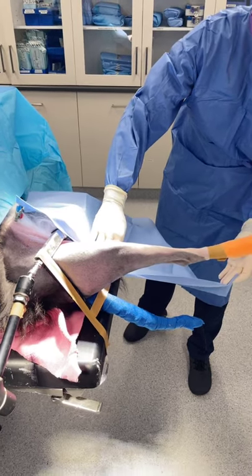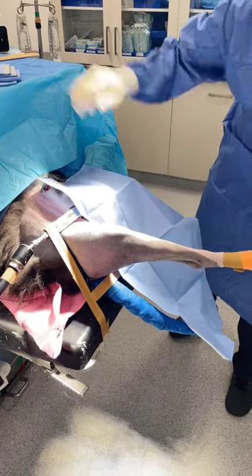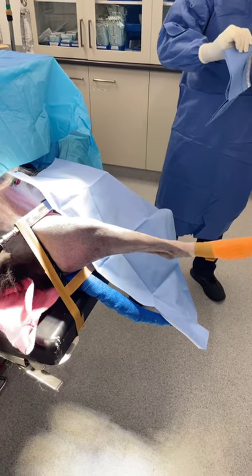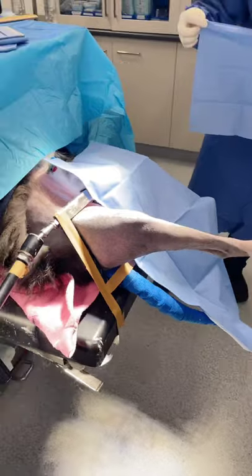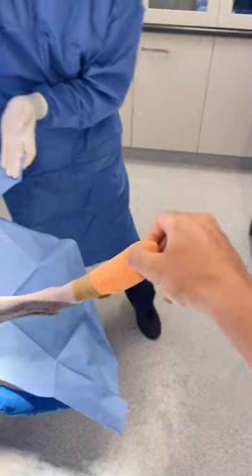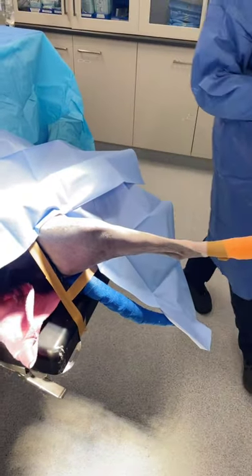This can be appropriate for a back leg or a front leg. We've basically wrapped a bandage around the foot and prepped the leg in a sterile fashion, and then we're going to prepare our drapes and get this patient ready for surgery. We have a leg positioning device — this jig here is used for the arthroscopy for the knee. In some cases you could have a towel clamp attached to the foot hanging from the ceiling or a drip stand. We can then do our final prep of the leg with chlorhexidine alcohol.